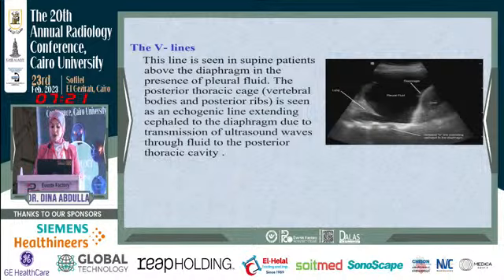And of course, lung collapse. Here is the patient with hemothorax and underlying lung collapse. Collapsed lung appears hypoechoic because it's not filled with air, but we can see multiple hyperechoic linear structures within. This is the air bronchogram, and they are crowded air bronchograms because it's a collapsed lung.